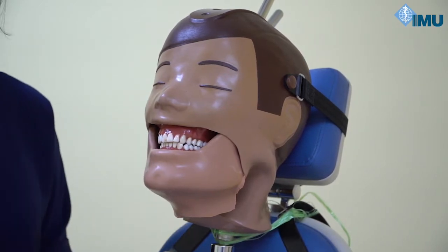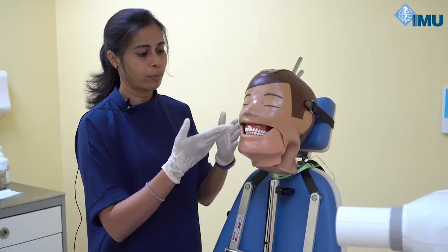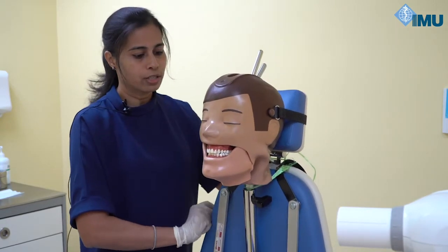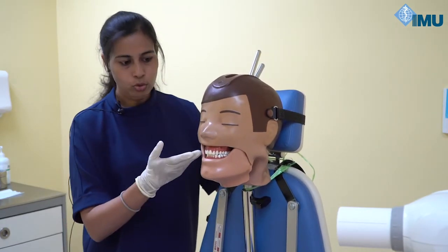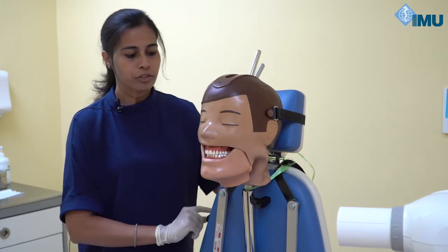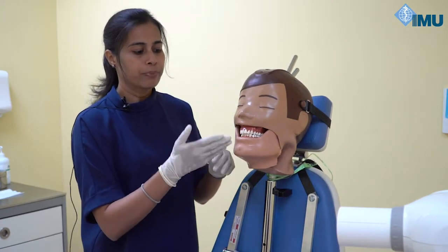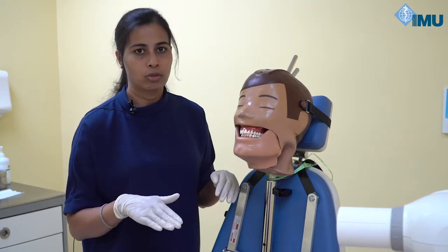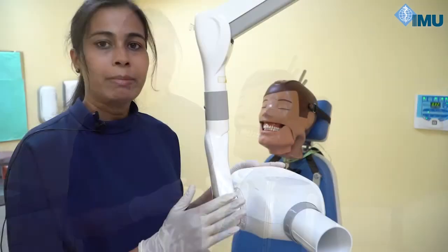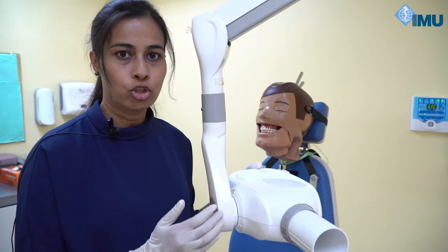Whenever you take projections for maxilla, the patient's head should be tilted slightly downward so that the occlusal plane is parallel to the floor. For mandible, the patient should look upward so that the mandibular occlusal plane is parallel to the floor. These two positions are standard for any intraoral radiographic technique.